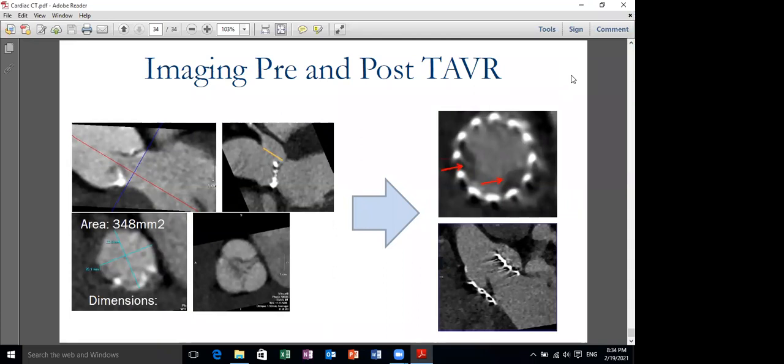In the evaluation of the mitral procedure, as Dr. Mohamed also showed in the slide, CT can delineate the anatomy. It can delineate masses. In paravalvular leak, it can detect the defect and quantify the defect and help the interventionist. If you need to put a plug, it can identify where this defect is, if there is multiple defect, and its exact or precise location.